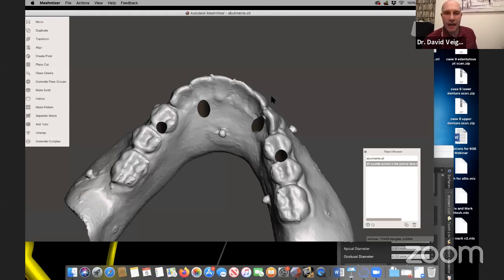Have you noticed fit issues with guides without pins? I just find that with pins, you have to hold things less. So the pins are essentially an extra set of hands, aren't they?